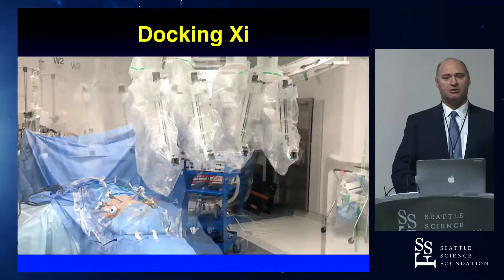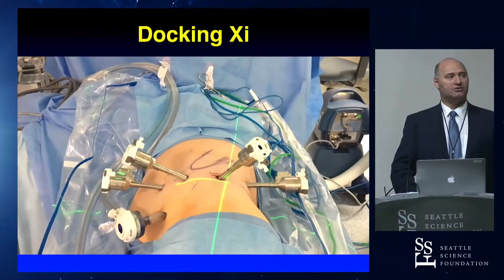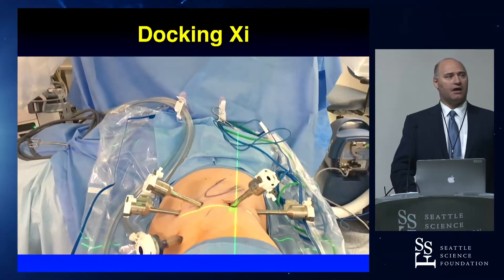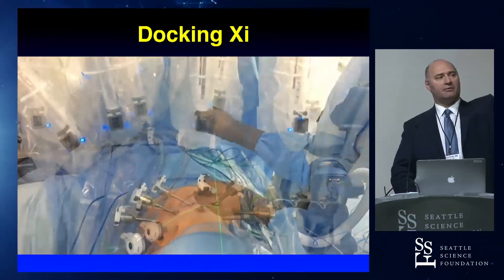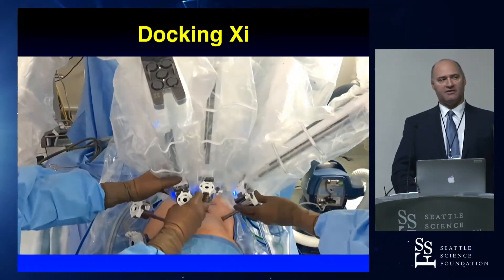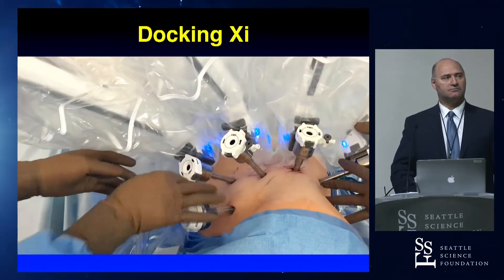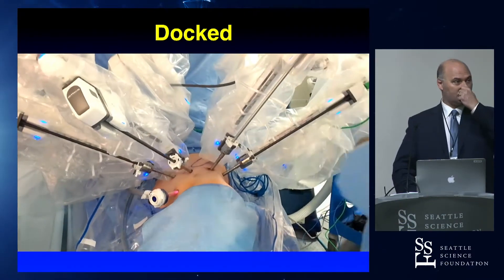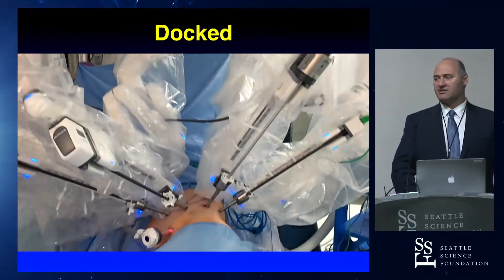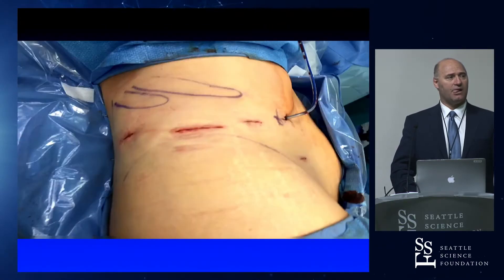Docking is much easier with the XI. You don't have to dock over the head — you can dock from the side, from the foot, any direction you like. We don't do any targeting. We put the X on the camera, rotate the horizontal line so it's parallel to our ports, bring the ports down, and that's it — no targeting necessary. We use a zero-degree lens for retro, which I find works the best. We extract the specimen through the camera port incision, which is a bit larger for that purpose.